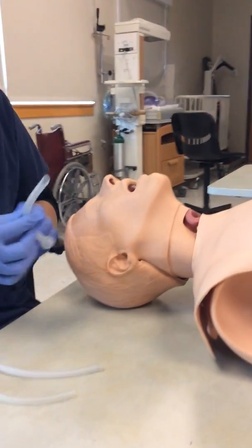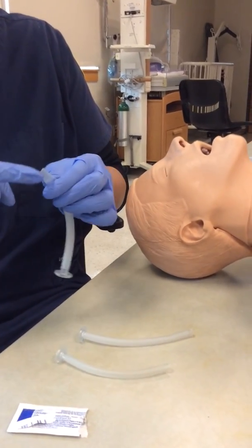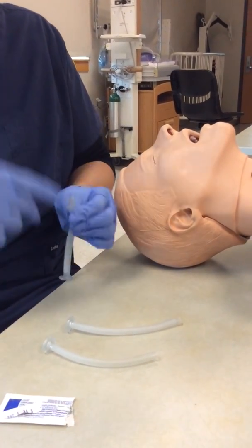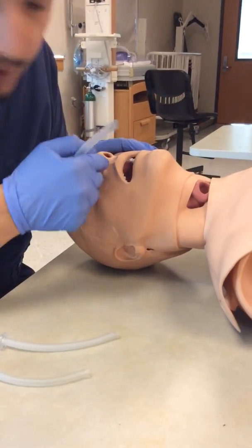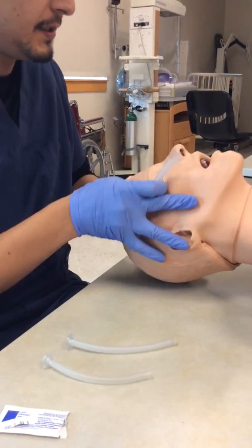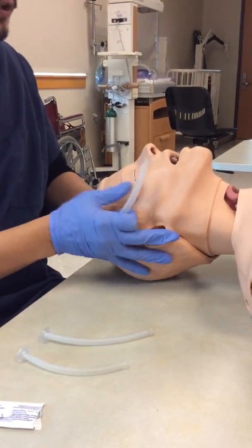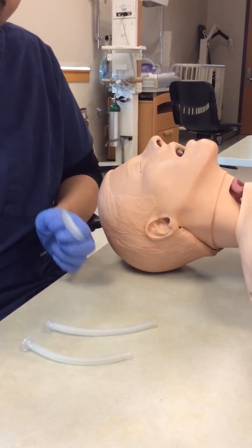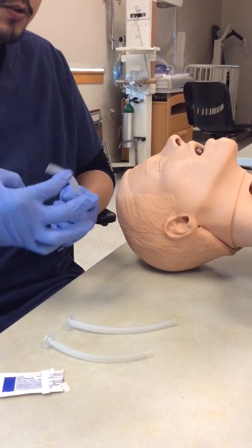And it's also important to choose an NPA that has an internal diameter smaller than the patient's nare. So this guy has some pretty big nares, so we're going to use this size NPA, and as you can see, it also fits. So before you begin, you're going to want to lubricate your NPA so it's easier to insert.